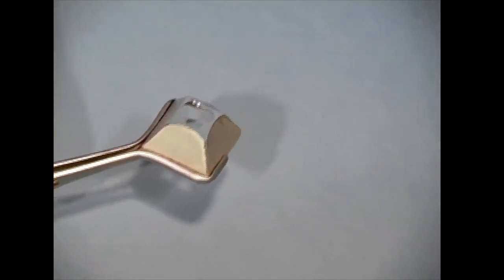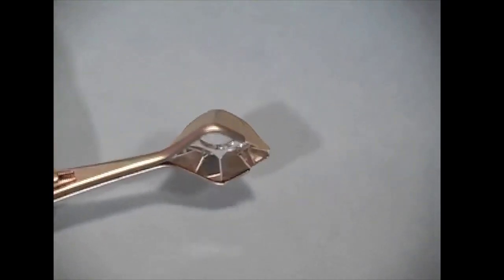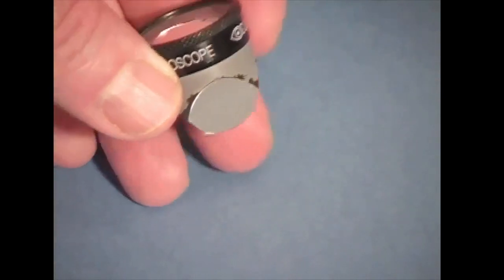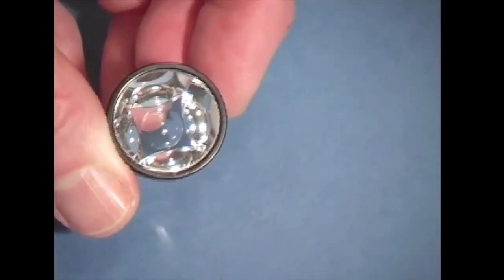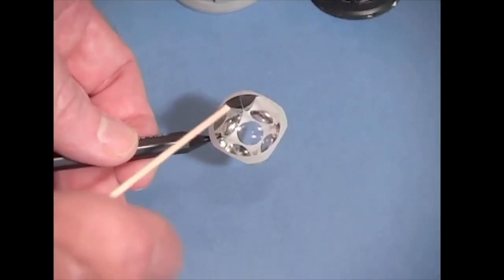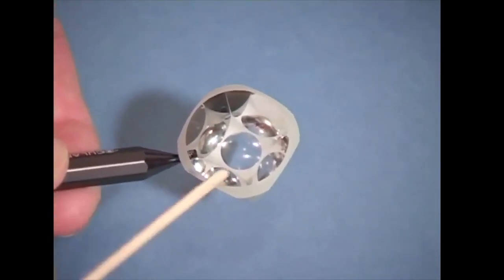So this is the 4-mirror lens. So this is a Zeiss, again, no longer manufactured. This is the Sussman, also with 4 mirrors, just no handle. And you can see that there are 4 mirrors, all of which point towards the iridocorneal angle.